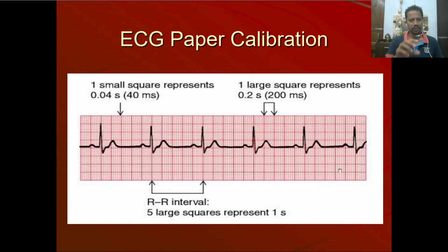All these amplitudes you have to remember and observe very nicely in each ECG, in each lead, because sometimes in non-Q MIs, in NSTEMIs, you might see just the amplitude of the R waves in V1 to V6 that has decreased and nothing else. There is no Q wave, there is no hyperacuity, there is no coving happening, and that will be just the sign of NSTEMI, and the T will be positive.